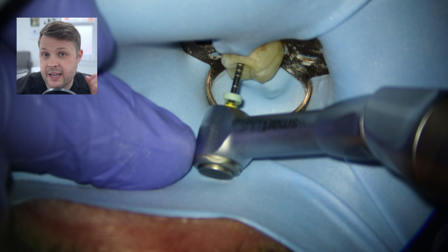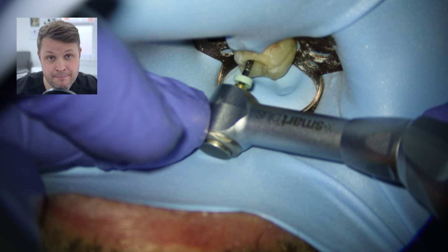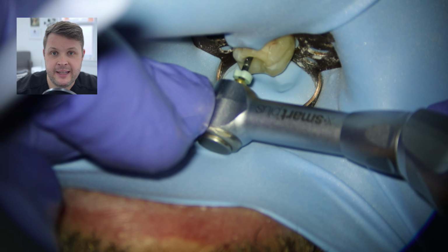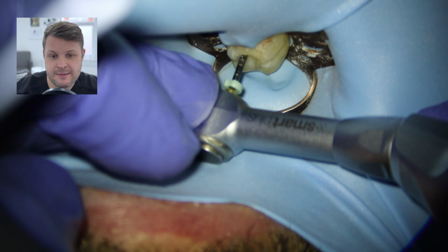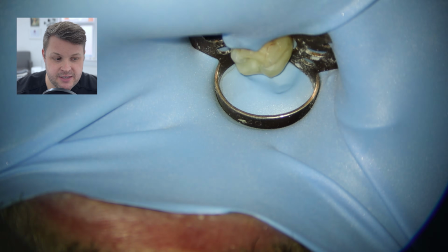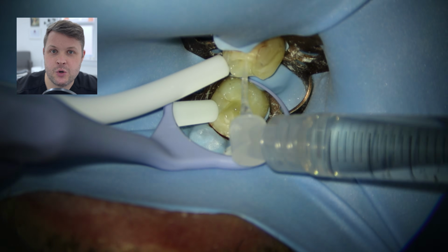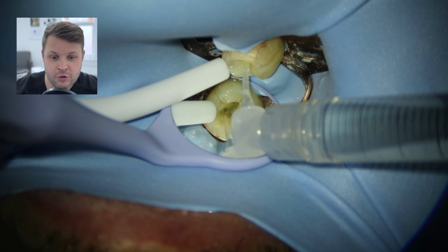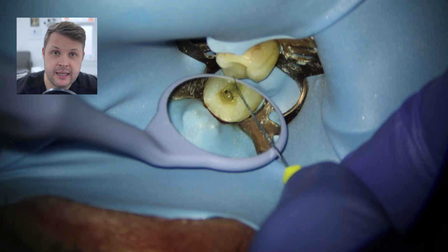And the reason why I've not gone from a 15 to 25, which I usually do in most cases, is because this canal is quite sclerosed, and I feel like I need to make a less of a jump or a less of a step up to make sure that I don't ledge the tooth or fracture a file at all. And then I'm going to recapitulate again.